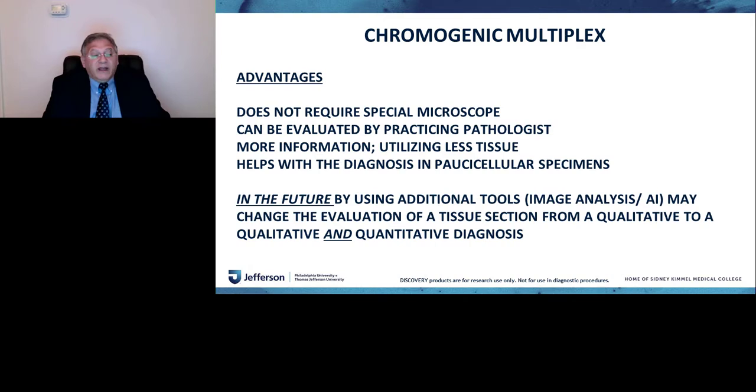It's going to be an extremely important thing in tumor diagnosis, especially nowadays, when tumor diagnosis is happening with minute specimens. The specimen on which the first diagnosis is made these days is usually an FNA or a small core biopsy, and then the oncologist requires so much information, including molecular testing, from these tiny little pieces of tissue, and this is where multiplex can be very useful.